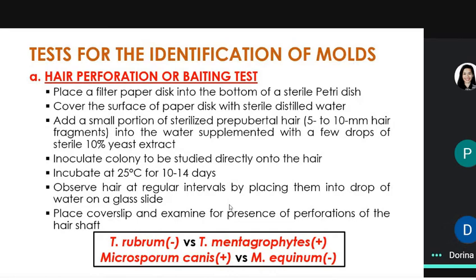Pero with this one, doon sa mentagrophyte kasi, pag hindi magkakatugma yung structure nyo later on, at kunyari ganong slide pa rin, at meron kang sinabi na ang macroconidia ay piriform, kanino ba si piriform? Di ba yung piriform yun yung maliliit? Yung mga parang tear shape. So pag hindi mag-coincide yung mga sagot ninyo, automatic irorong ko na yan lahat.